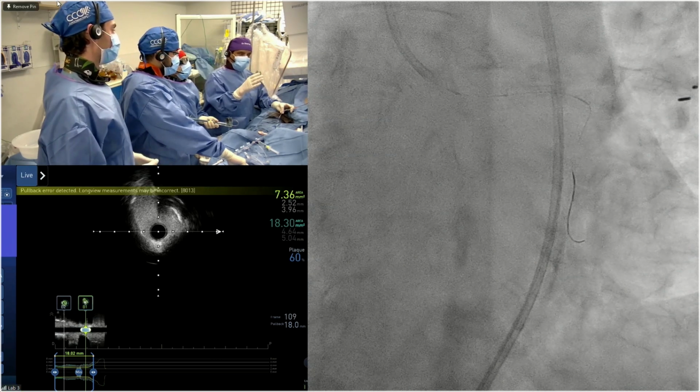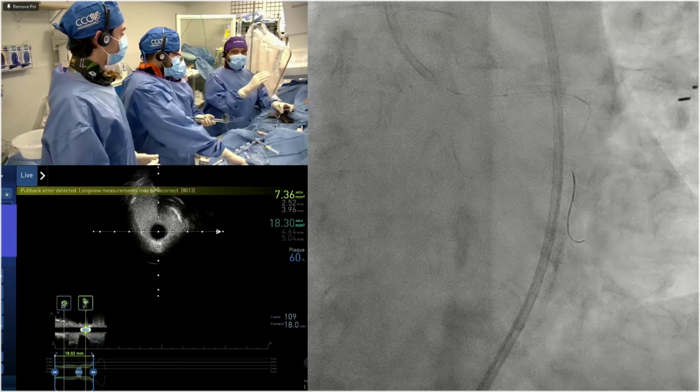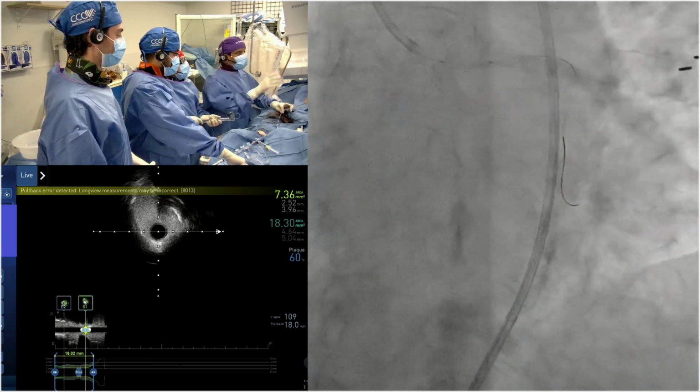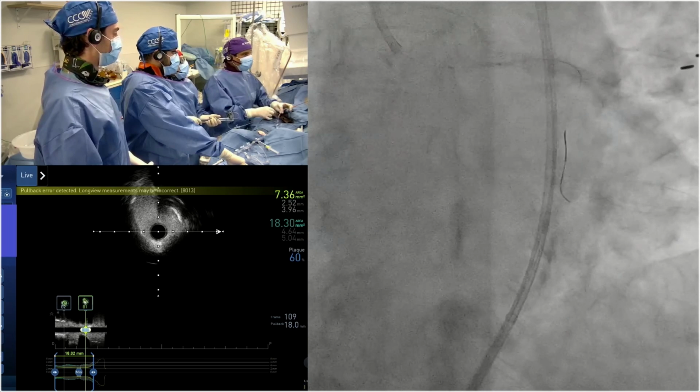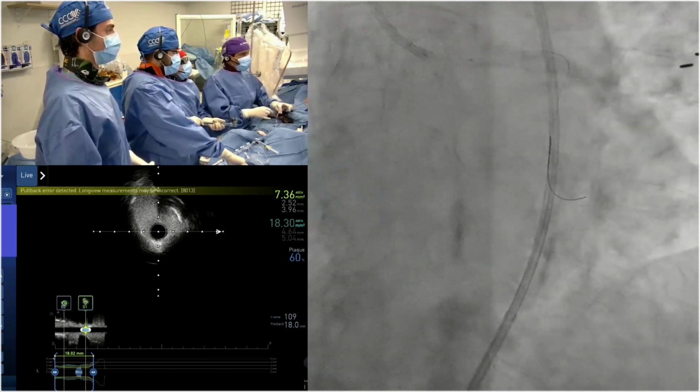After 10 years, the benefit was also there, with a p-value of 0.058, but compared to the other group, it's like 0.02, 0.01. So the question, if imaging has to help in this particular case, will be whether the ostial circ is truly involved or not. That to me will be the big one.